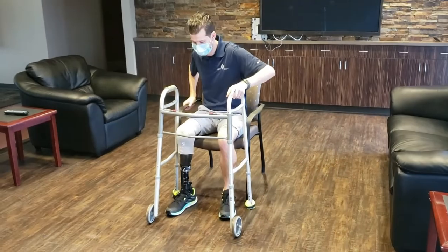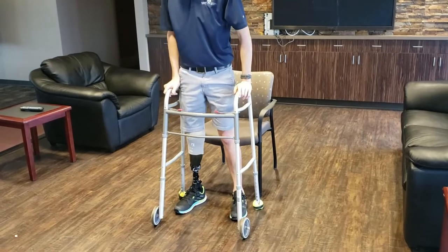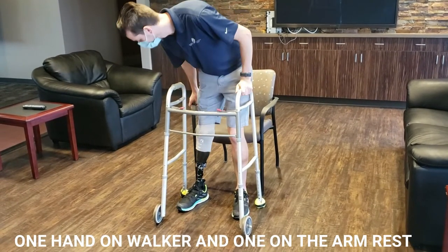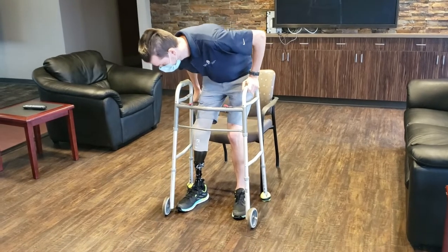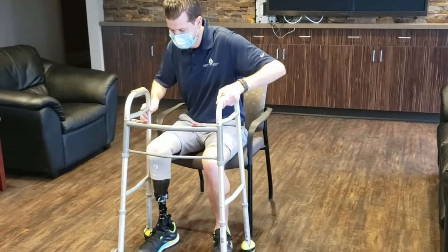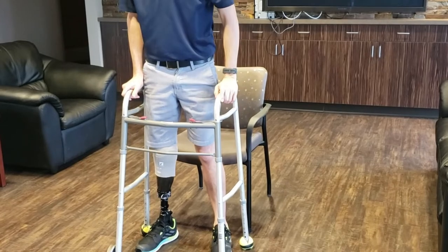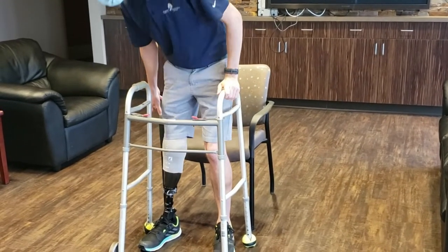When you are sitting in a rigid chair and standing up using a walker, have one hand on the walker and the other hand on the armrest so you can push up a little bit. When you sit back down, reach back for the armrest. You'll also notice him scooting out in the chair a little bit before he tries to stand up, and that's going to be an important trick as you move toward doing this without a walker.